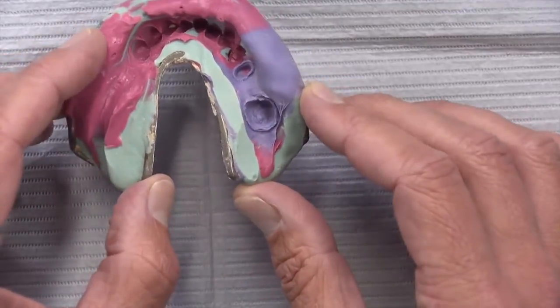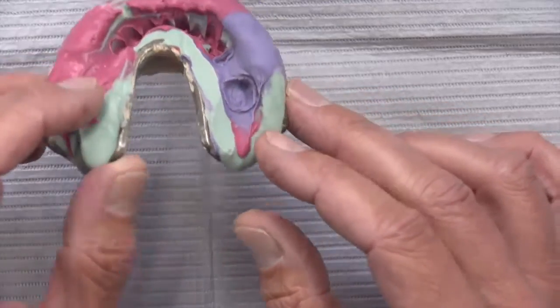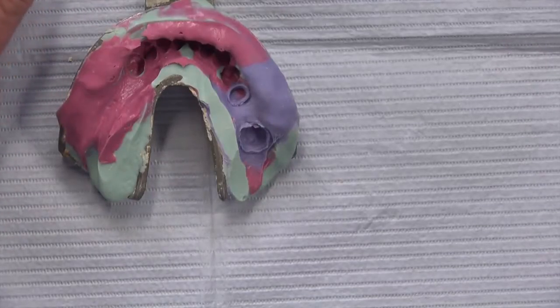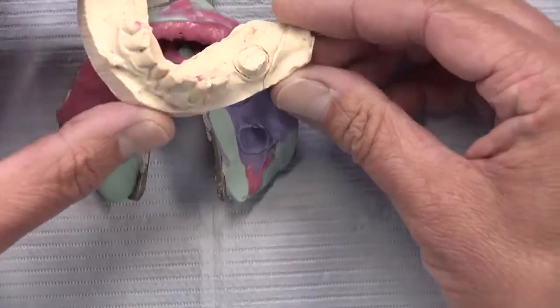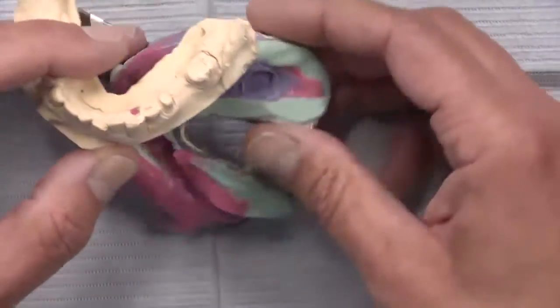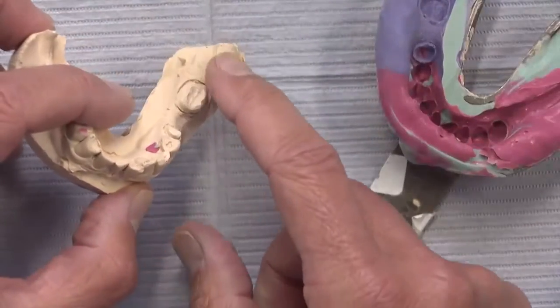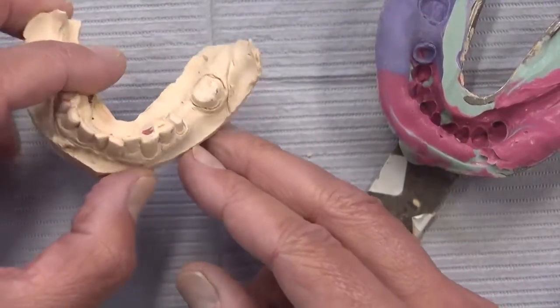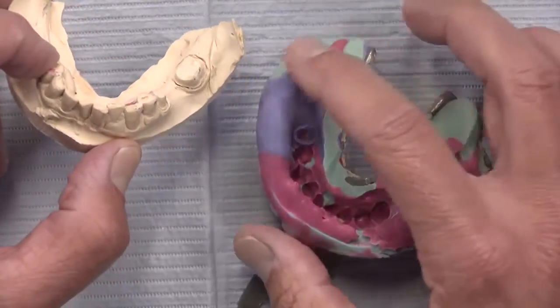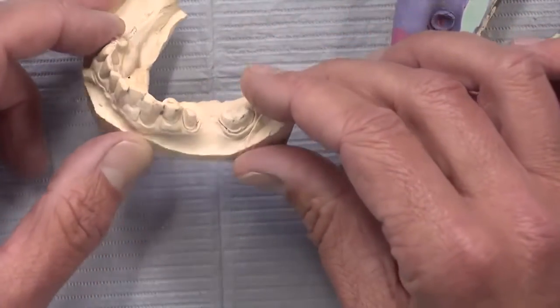And that doesn't even take into consideration the fact that we have some compression of the material and a tight fit that needs some extra dye spacer. And so when you look at a model that's been poured up, you can see things. As you look at this, you can see extra material over here, and this is represented by where the purple material stops, and we have the green material. So you can very clearly see where those two areas come together. Now, obviously, that's not in an area that's of consequence here, but when you have an area where the material stops and it happens to be on an occlusal surface of a tooth, that's problematic.